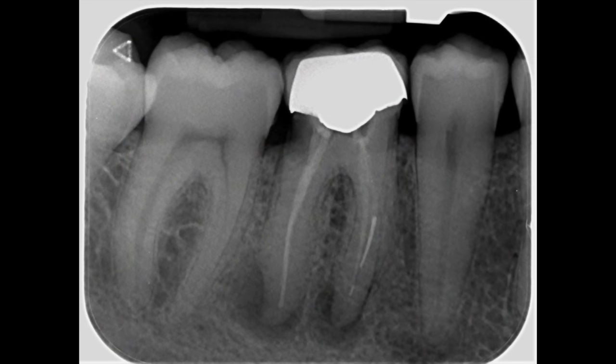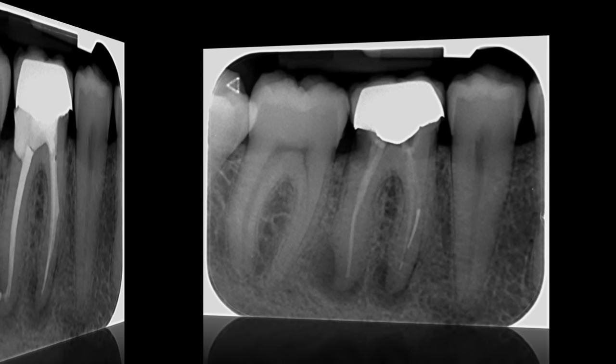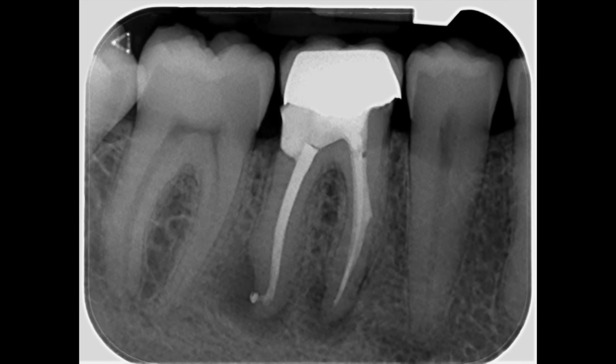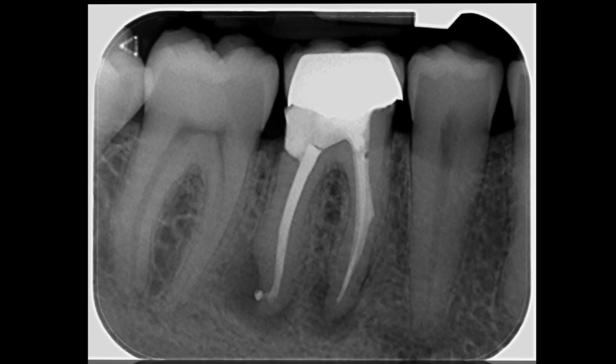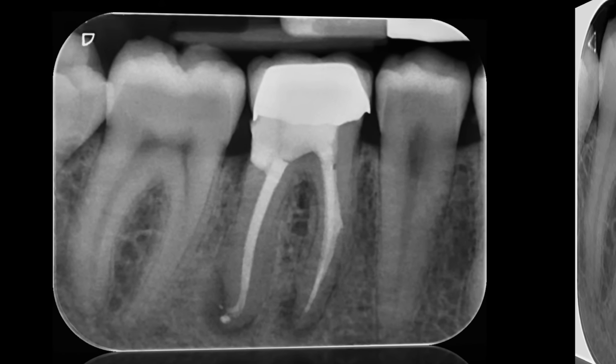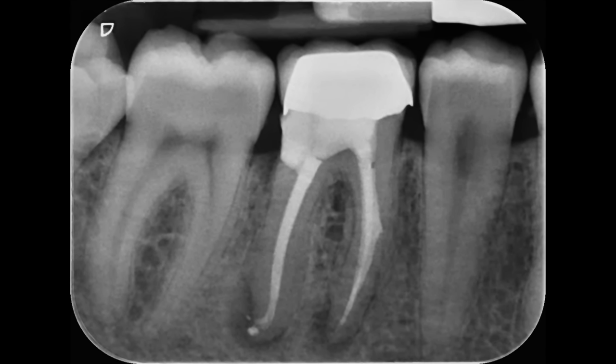So here's that preoperative radiograph again showing all the hurdles that we had to overcome during this retreatment. The caries, the fractured file and the retreatment. Here's my post-operative result showing a good coronal apical seal, and I've reused that crown as a temporary restoration whilst we're waiting for review appointments. This is the first review that was carried out at 6 months, and it does show some evidence of osseous healing apically. The next review will be in 1 year.